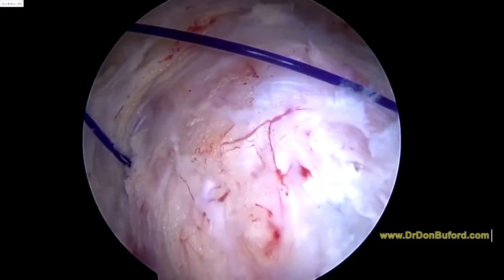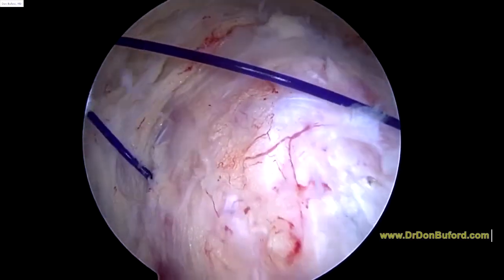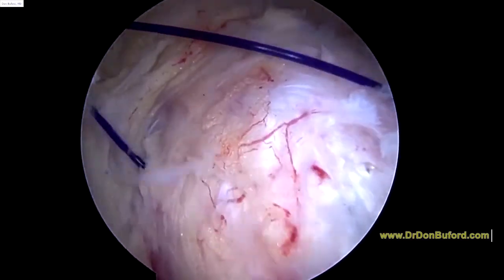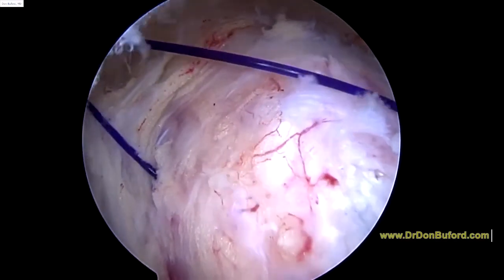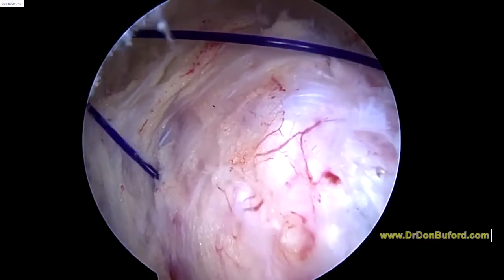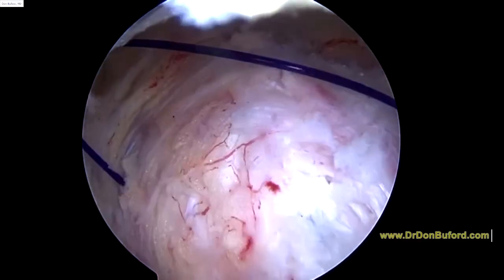So here we're going to go ahead and tie the suture. This is a type of knot that has a funny name — we call it a Tennessee slider. This suture is an absorbable stitch; it's just designed to hold the tendon edges together until they heal.